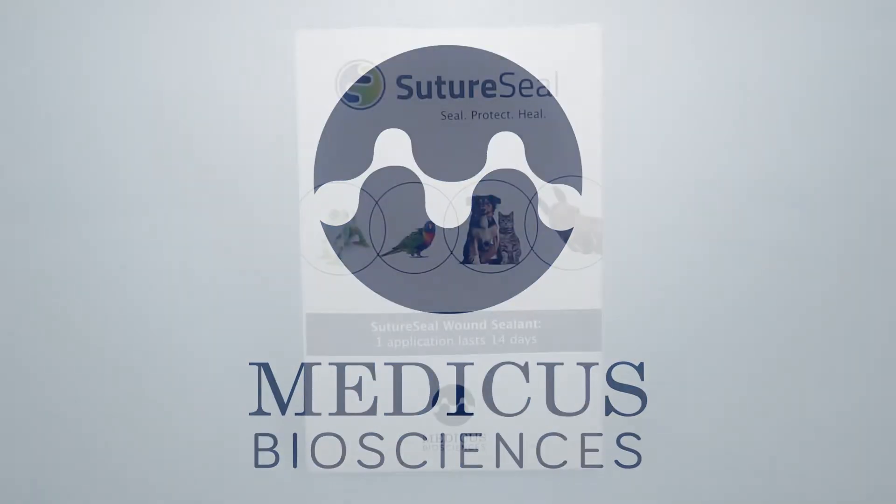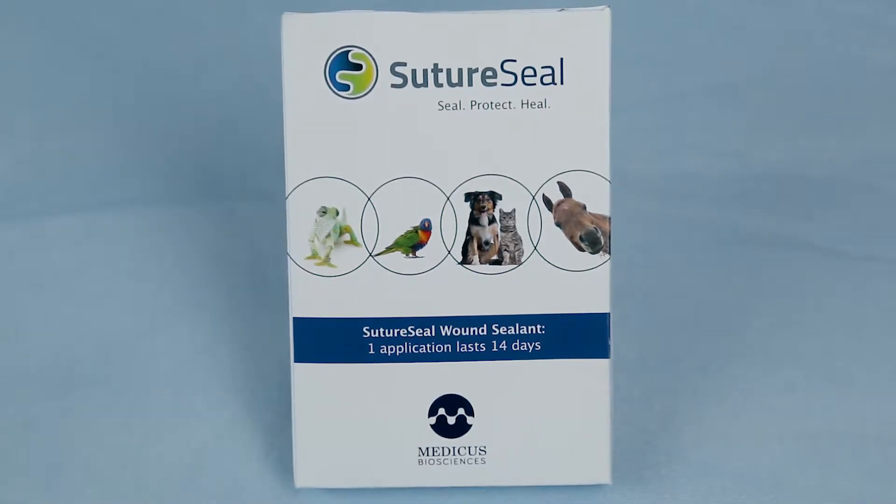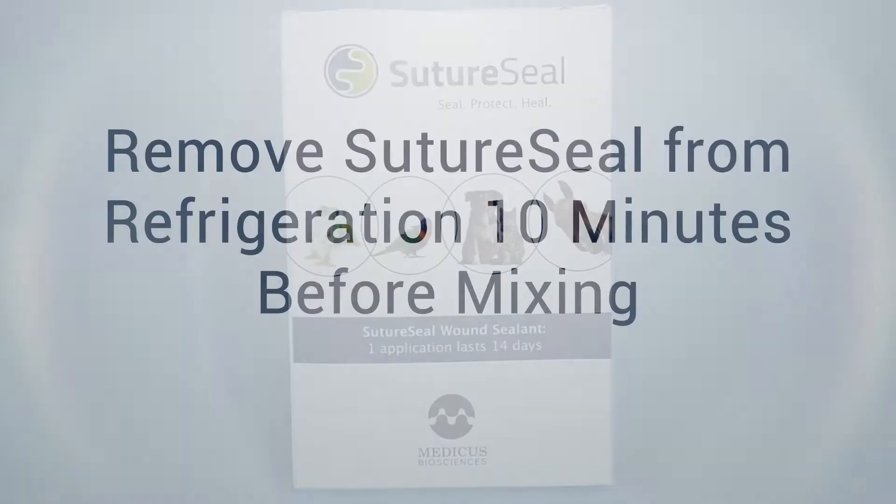Please note in this video we are using a single Suture Seal packet that contains enough polymer for a 15 centimeter long suture or equivalent square wound area. Also remember that refrigeration of Suture Seal is recommended if the product you have received is not used within five days of receipt.